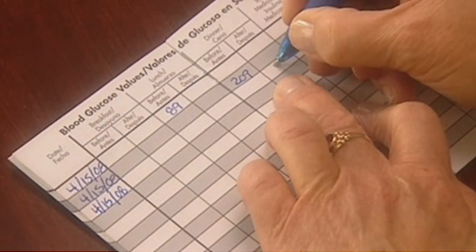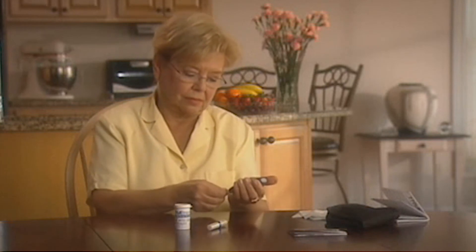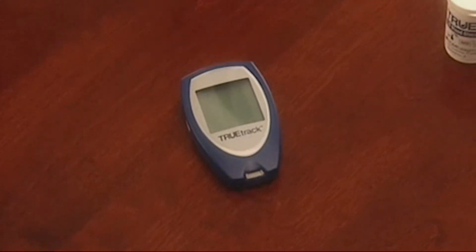Once you've recorded the result, remove the test strip and discard. The meter will shut off automatically. The test result is then stored in the meter's memory for easy recall or to use for averaging of results.